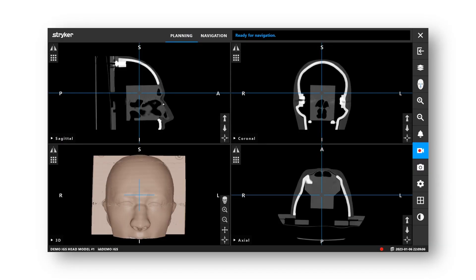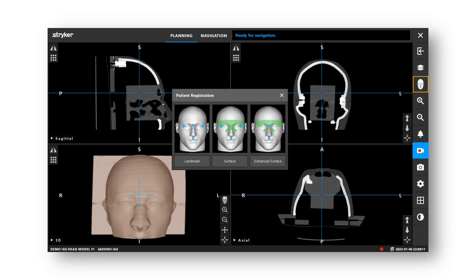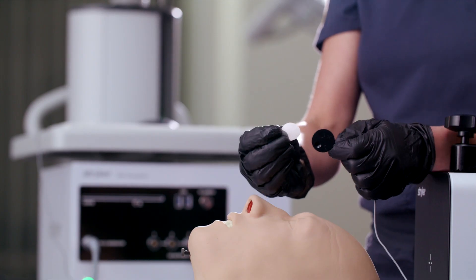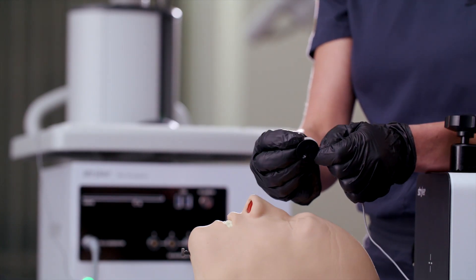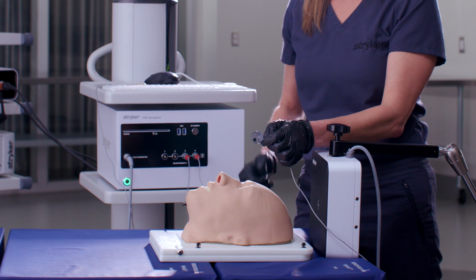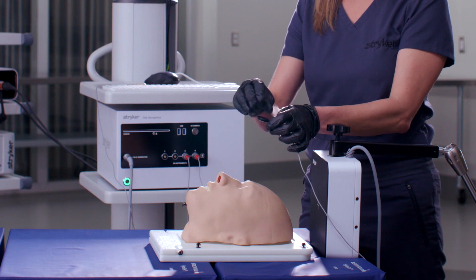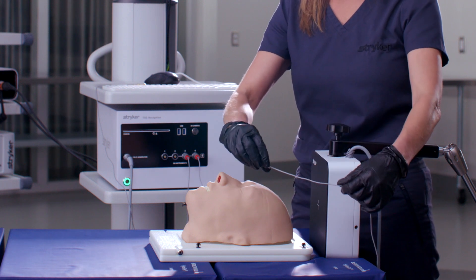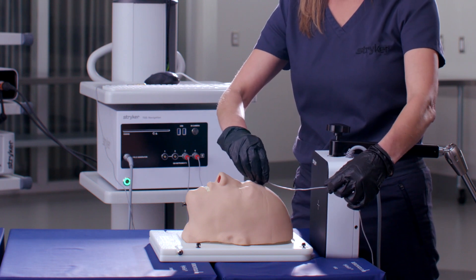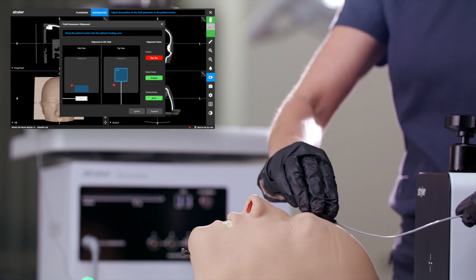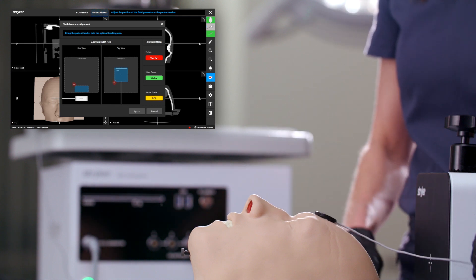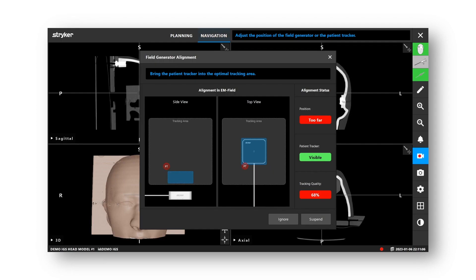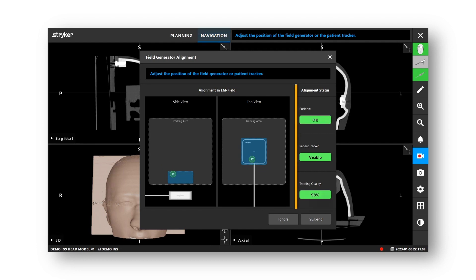To select your method for patient registration, click on the head-shaped icon in the side panel. The ideal registration method is Enhanced Surface. Apply the Patient Tracker tab directly onto the patient tracker and place on the forehead with the cord facing away. Once the patient tracker is placed, utilize the Field Generator Alignment dialog box on the screen to ensure your patient tracker and field generator are optimally aligned.